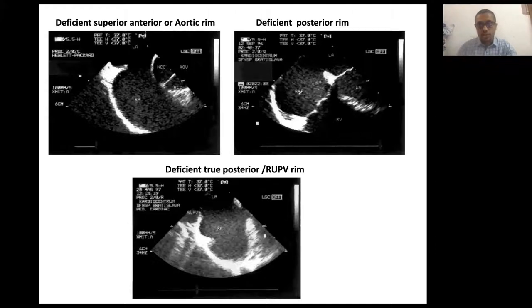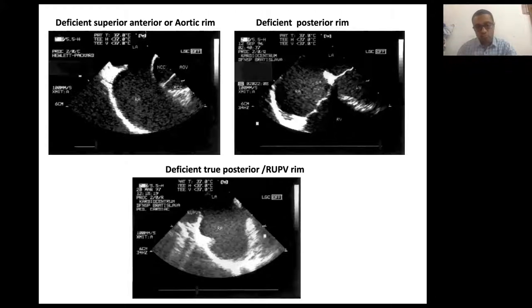This is a case with deficient posterior margin. In the long axis view at 125 degrees we see the right upper pulmonary vein, and there is true deficiency of the posterior margin.